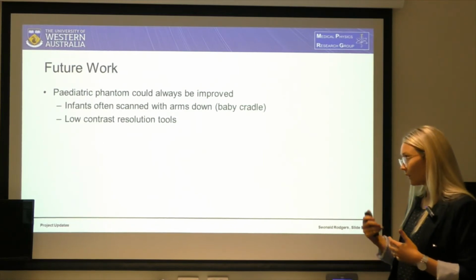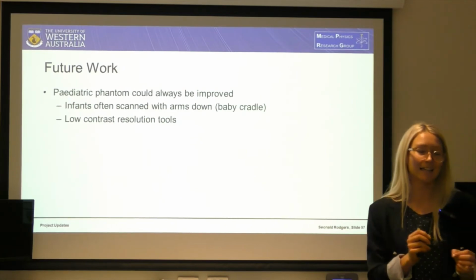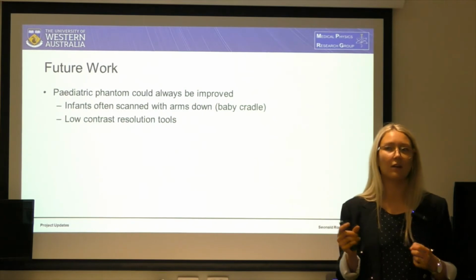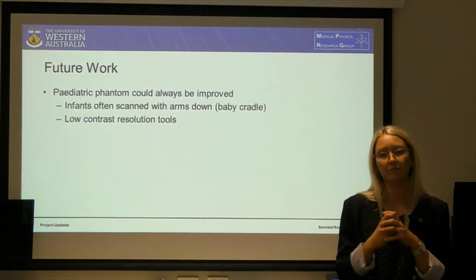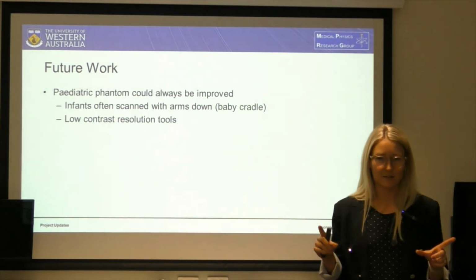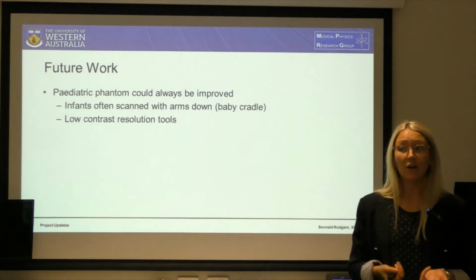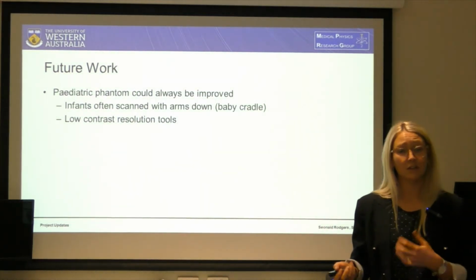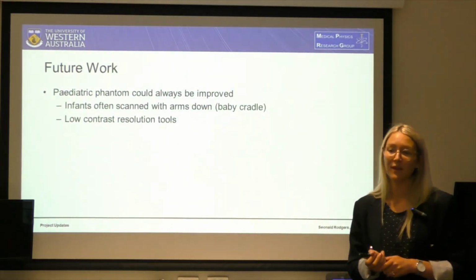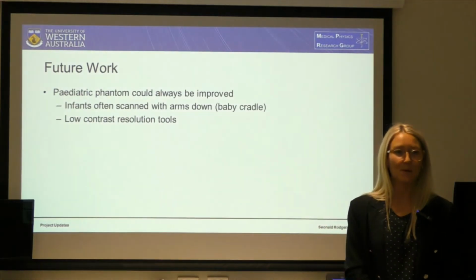As well, the low contrast inserts of the phantom didn't work exactly how I wanted them to. Although they worked, they weren't very close at assessing the limitation of the low contrast resolution, which I hypothesise is lost when using the tin filtration, which I was not able to validate using my phantom. But for now, that's all, and thank you very much everyone for your support, and thank you for listening.